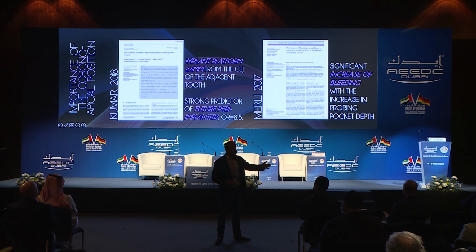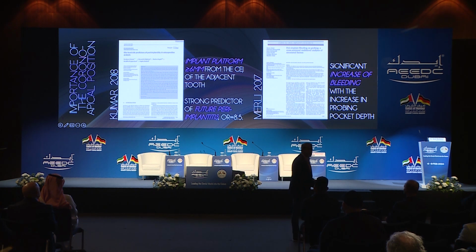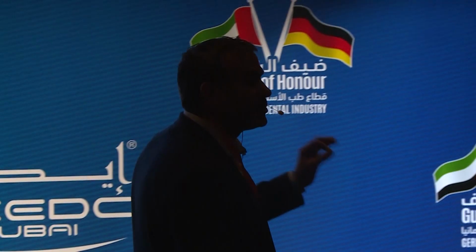And Ricardo just spoke about this morning: how deep, the deeper, how are you going to clean? How is the patient going to clean? This is at 8 times more risk for peri-implantitis after 5 years. So imagine, we're placing the implant today and you're going to see this patient in 5 to 10 years. So, this is unacceptable in today's implant dentistry.